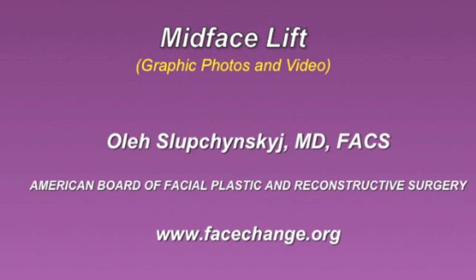In this educational video, we'll be showing some intraoperative photos and video of a mid-facelift. We will also look at some before and after photos of patients who have had mid-facelifts.